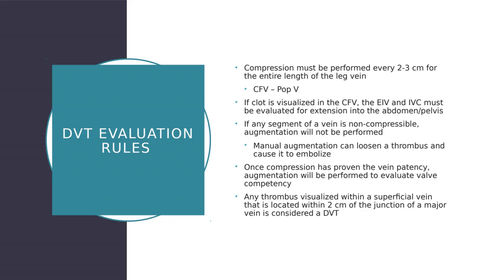The reason why those techs shouldn't be doing that is because just because you're starting at the common femoral and it compresses there doesn't mean that it's going to compress at the popliteal, and you don't know that. So now you've gone the entire length of that leg and you've compressed it, you've augmented it probably 5 or 6 times.